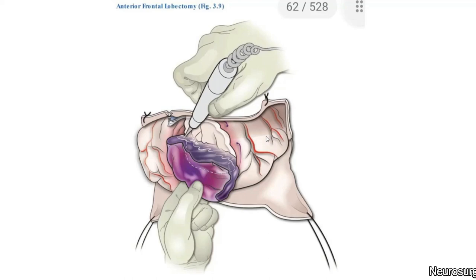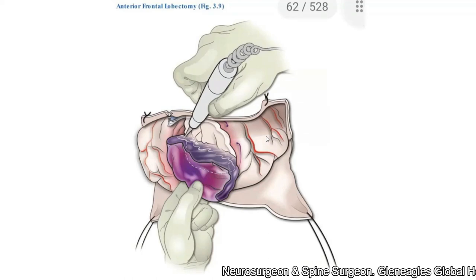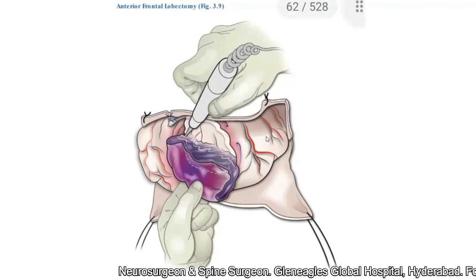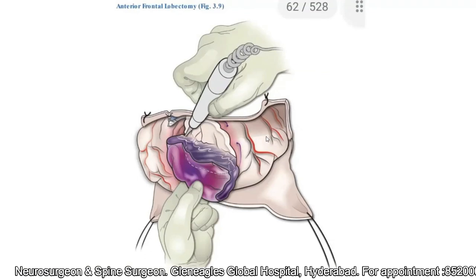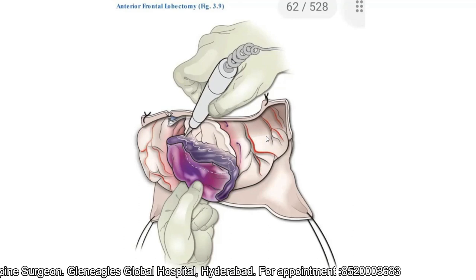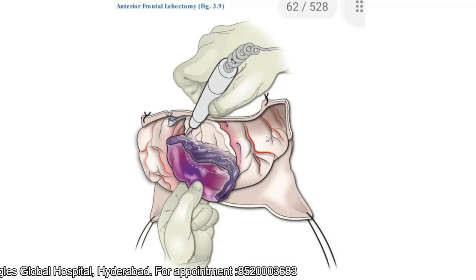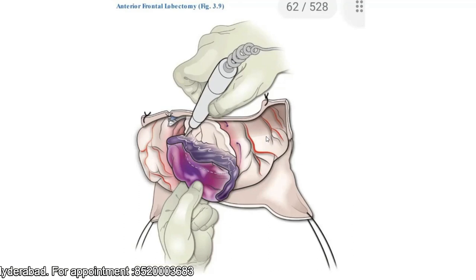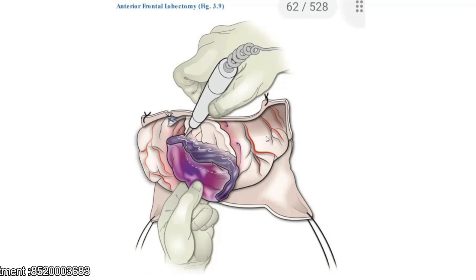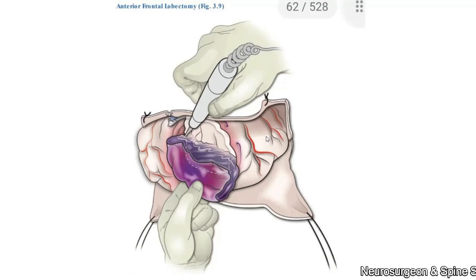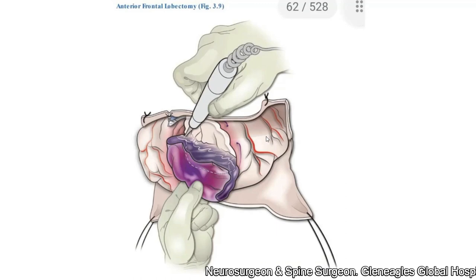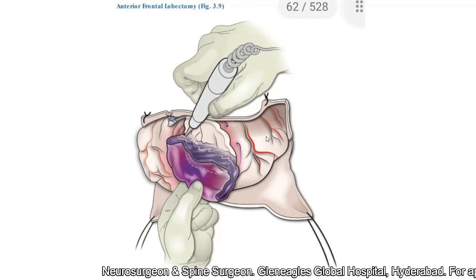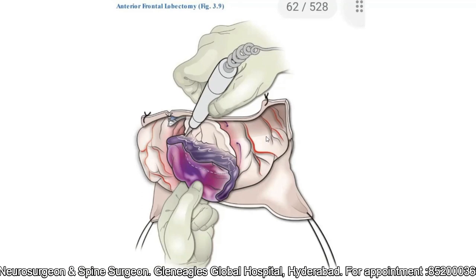The margin of resection depends on the size and appearance of the contused frontal lobe. If the contusion is diffuse, one may begin the cortical incision seven to eight centimeters from the frontal pole and extend laterally to the level of the lesser wing of the sphenoid. The medial aspect of the cortical incision should be made where the frontal lobes are clearly separate.